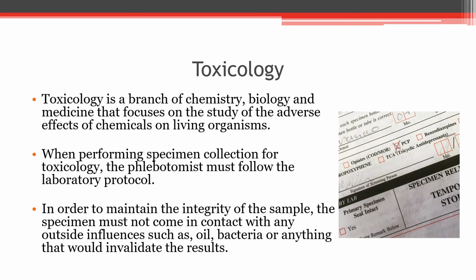Toxicology. Toxicology is a branch of chemistry, biology, and medicine that focuses on the study of the adverse effects of chemicals on living organisms. When performing specimen collection for toxicology, the phlebotomist must follow the laboratory protocol. In order to maintain the integrity of the sample, the specimen must not come in contact with any outside influences such as oil, bacteria, or anything that would invalidate the results.